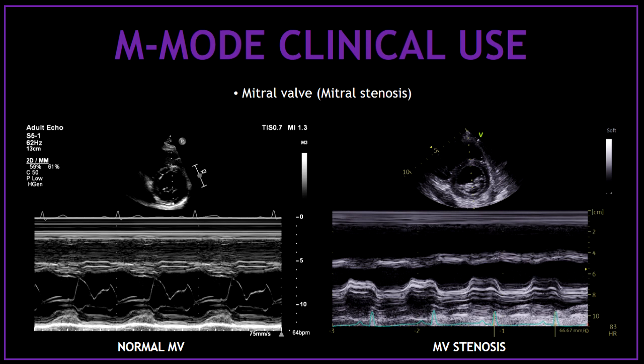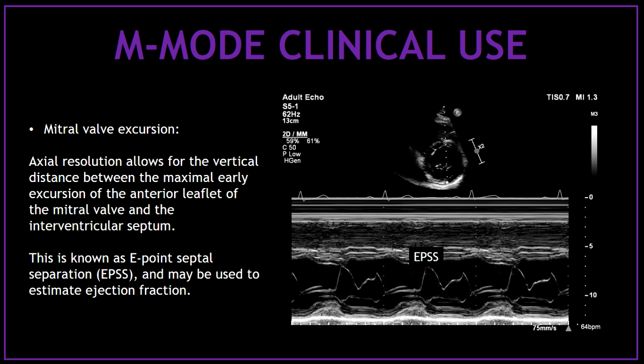Another common view where you can use the M-mode to assess the mitral valve is the parasternal long axis view. By using the M-mode across the mitral valve, we can also obtain information about systolic function. The E-point septal separation (EPSS) is a measurement used to estimate ejection fraction. This is basically the vertical distance between the maximal early excursion of the anterior leaflet of the mitral valve and the interventricular septum. As you can see, the mitral valve excursion not only gives us information about the mitral valve, but also important information about the left ventricular function and hemodynamics.